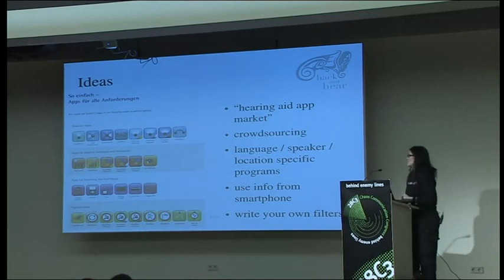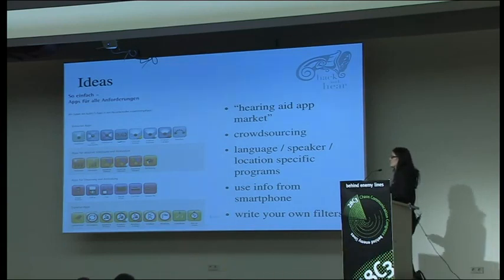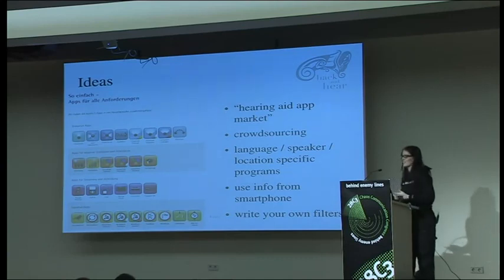And the funny thing is, when I was browsing through the websites of the vendors, the marketing of some hearing aid companies actually got this idea already. They just call their features apps. So, I mean, it's just an enumeration of what the hearing aid can do, but they just call it app.